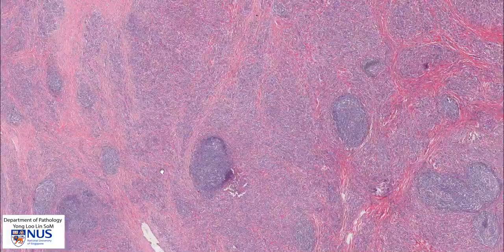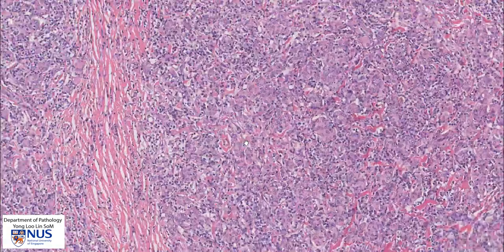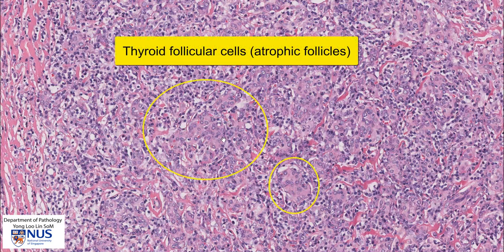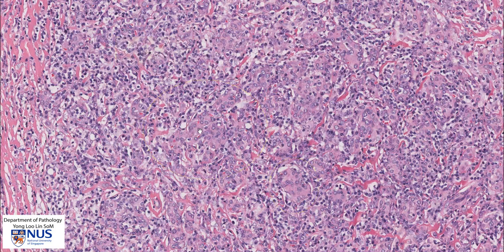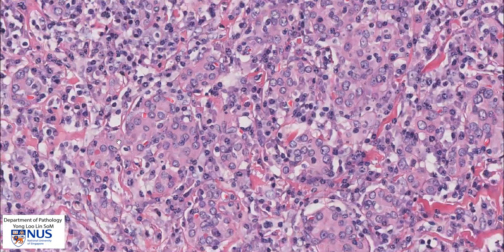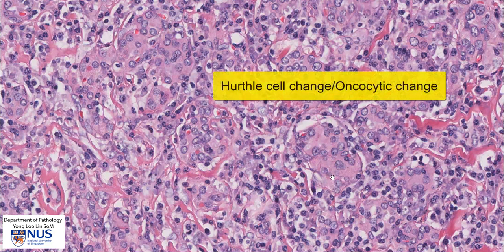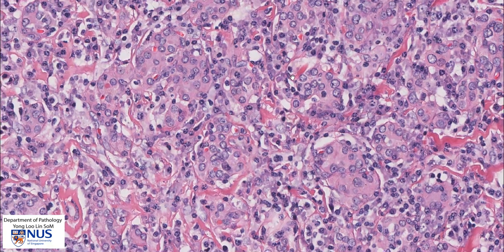Looking at these more diffuse areas, we can see several different cell types. These pinker nests of cells are follicular cells. The thyroid follicles are atrophic with hardly any colloid, and the follicular cells themselves exhibit some interesting features. The cells are enlarged and contain abundant pink granular appearing cytoplasm — this is known as hurtle cell change or oncocytic change. In between the follicular cells, we see a lot of very small cells with rounded nuclei. These are all infiltrating lymphocytes.